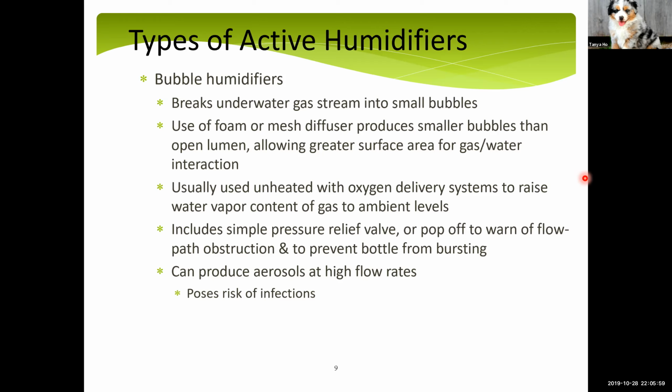Okay, usually we don't have heated bubble humidifier systems, but again, this is used pretty much exclusively with nasal cannula. And so anytime the nasal cannula is at 4 or greater, or anytime the patient tells you they have a dry nose or anything like that, you add a bubble humidifier.